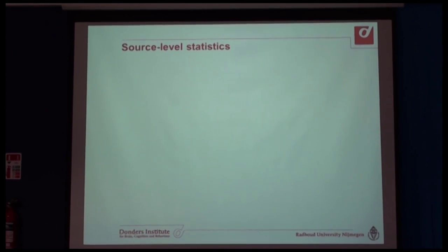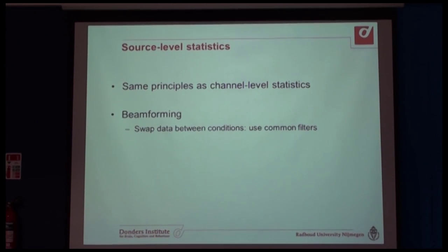Okay, so far I've been explaining everything for the channel level, but the same thing holds for the source level. And I think it is important that with MEG data we go to the source level. That's the whole point of having a whole head many-channel MEG system. So for source level, the same principles apply.